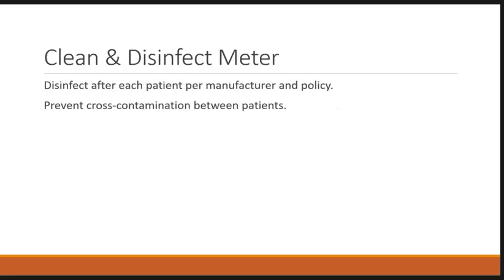The final step in the process is to clean and disinfect the meter. Following patient testing, the glucose meter should be cleaned and disinfected using approved disinfectants and procedures recommended by the manufacturer. Proper disinfection prevents cross-contamination between patients and helps maintain compliance with infection prevention standards.